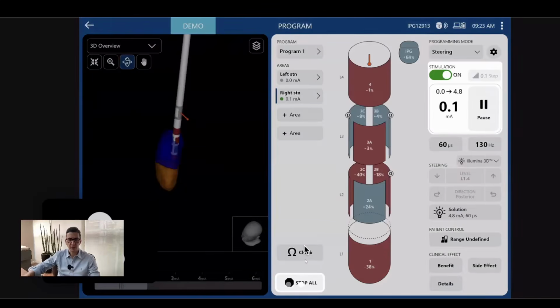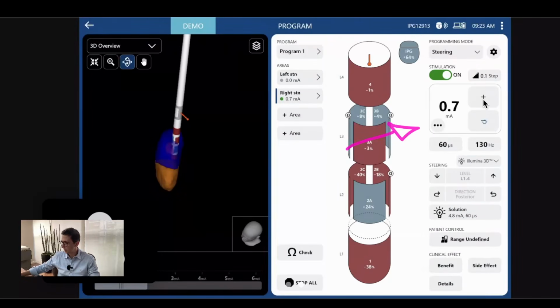And once the software starts to increase the stimulation, I'm going to pause because the patient is in front of me, for example, and then you have to cancel. Okay, so now I'm going back to 0. And once I do that, I have 0 milliamp, but I already have all the settings here. And here's my electrode. So let's, for example, start to program a patient.